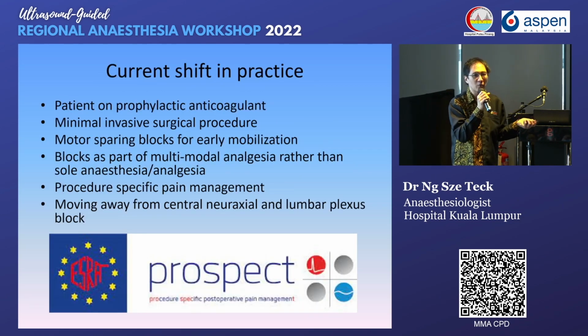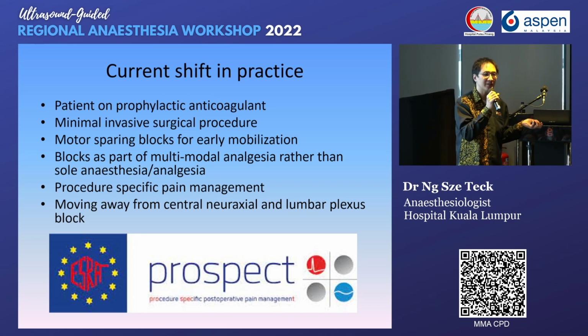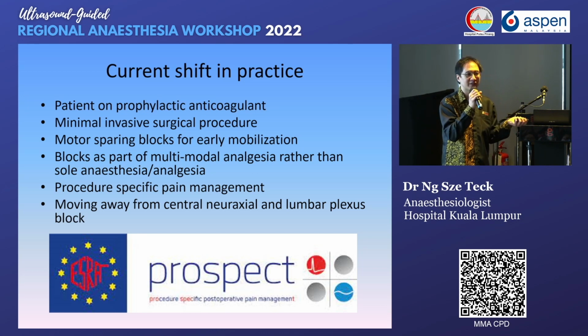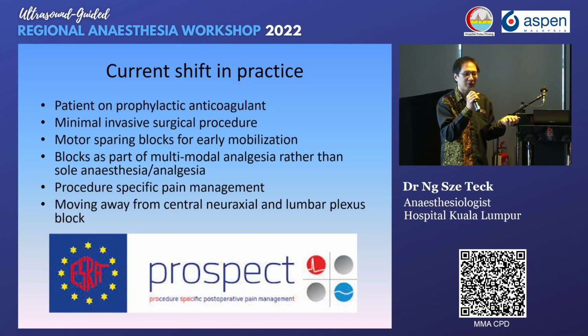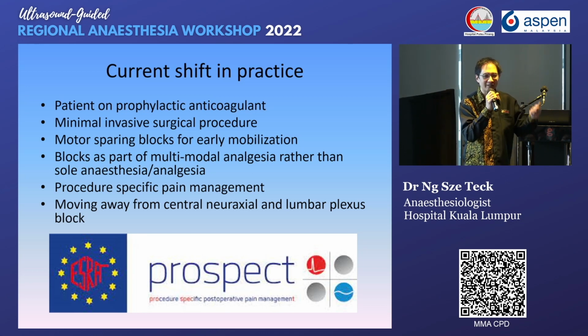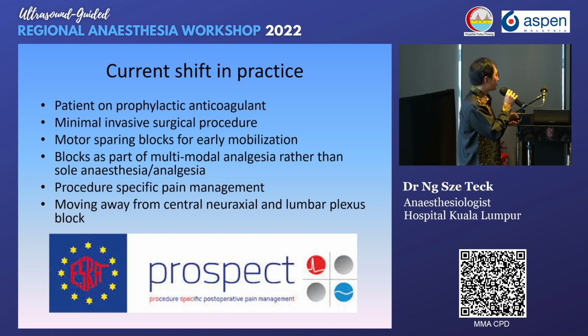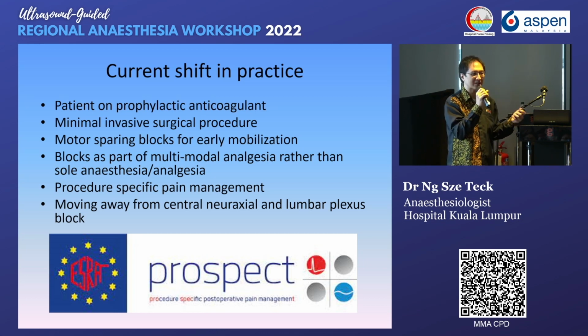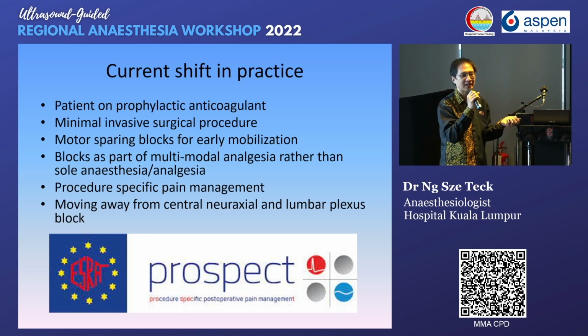Now surgeons are going more and more minimally invasive. Some of them, like your TKR, your THR, they want the patient to mobilize early. They're going minimally invasive. They don't want you to do central neuraxial anymore. They want something that can promote early mobilization for the patients. And blocks can now become part of multimodal analgesia.